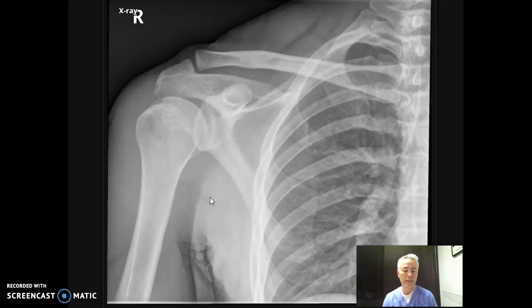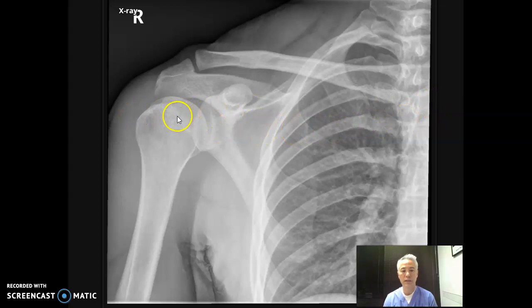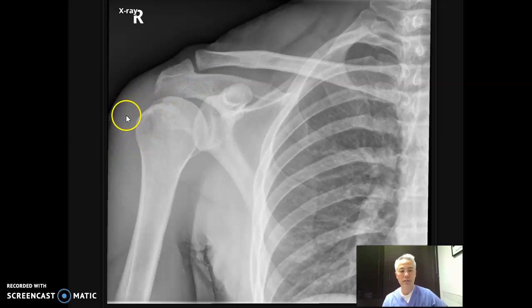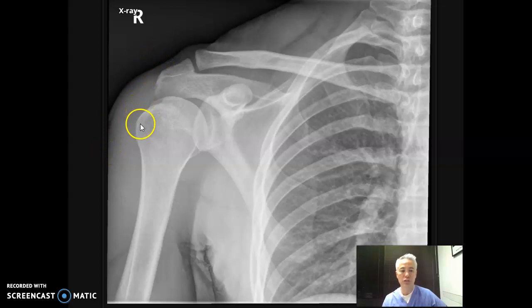You're going to leave your collimation open pretty much to 10 inches top to bottom on almost all your patients. Side to side, there is an opportunity to collimate a little bit if you have a patient that is a little bit more narrow through the thorax area. For the medial border, the head of the clavicle needs to be all the way on there. If you're lining down the mid-sagittal plane, the edge of your image with your light field should go down through the middle of the chest, so you want to see about half of the vertebral bodies, which will ensure you get the entire head of the clavicle. On the lateral side, you need to see the greater tubercle towards the outside, and the entire head of the humerus. Side to side, you don't need to get all the way to the soft tissue, but you do need some of the soft tissue to ensure that part of the bone is on there.